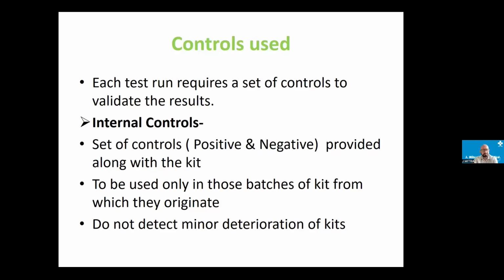We have a good amount of hepatitis B samples, and last month we had one NAT positive hepatitis B sample where CLIA was found to be negative, non-reactive. So we use both systems in our institute, both CLIA and NAT. But according to the Drug Act, if CLIA is positive, then we have to discard it.